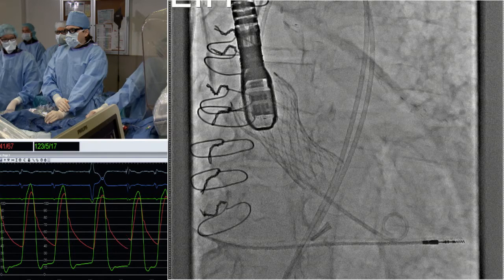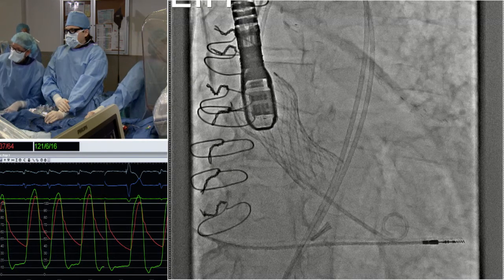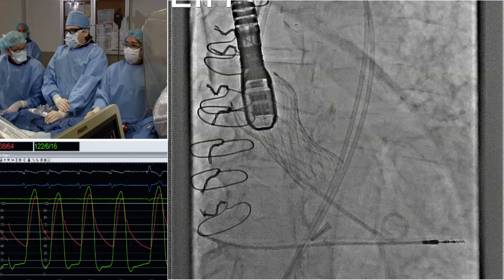I don't think you have any concern with pop-out in this valve. Can you check the pace? Perfect.